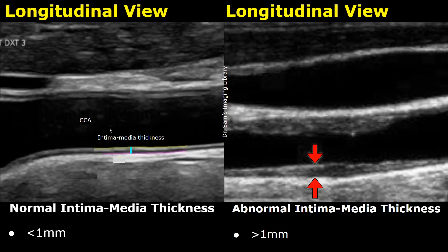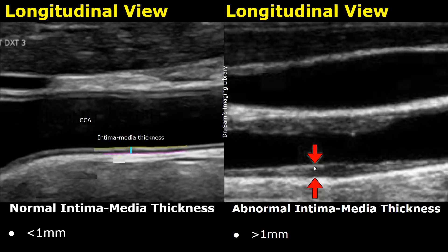Here is a longitudinal image of the common carotid artery showing the normal intima media thickness. The normal intima media thickness is less than one millimeter. Over here we have an abnormal intima media thickness — when it is more than one millimeter, there is increased risk of atherosclerosis and thrombus formation.